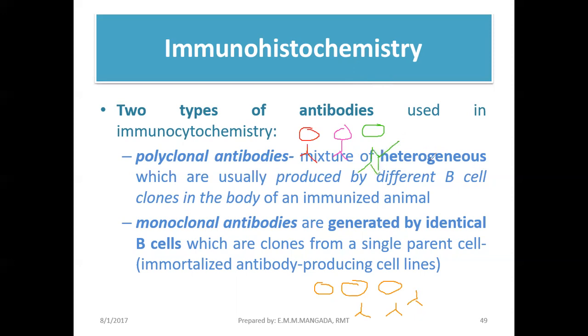So, napansin ninyo, okay? For example, we're going to use these antibodies in the detection of certain diseases, okay? Of a certain disease. Okay? So, pwede natin gamitin lahat to ng antibodies na to. At ganun din itong mga antibody na to. Okay? So, halimbawa, we have this antigen. Okay? For example, an infectious disease. Meron tayong antigen. Ito guys, kunwari yung antigen natin. Okay? So, meron tayong antigen.